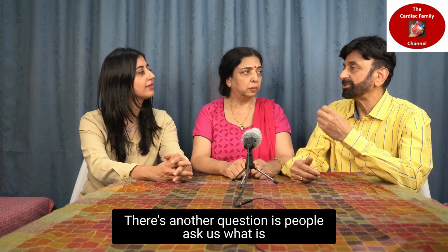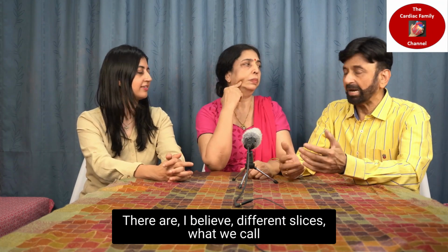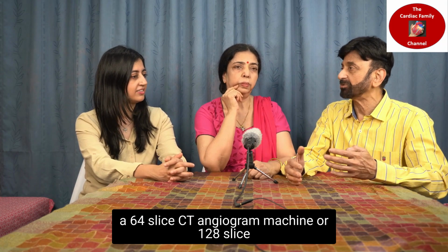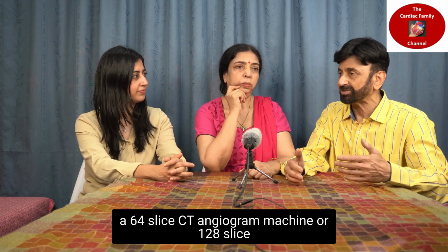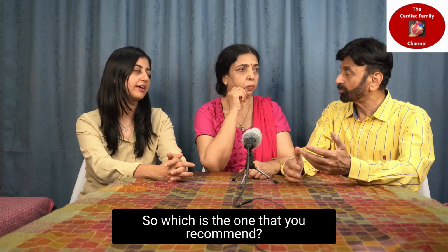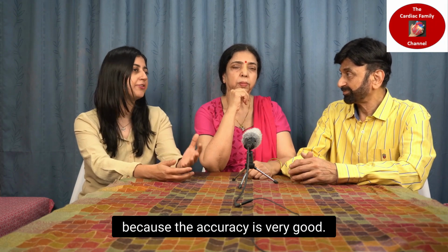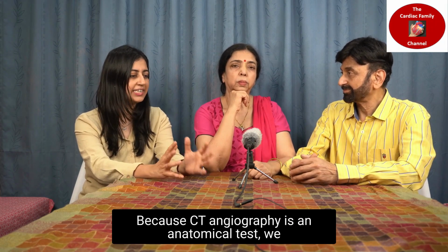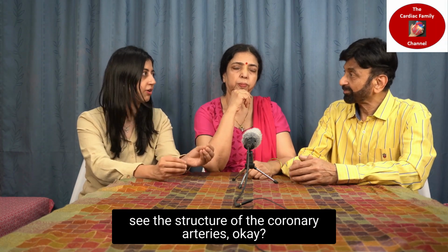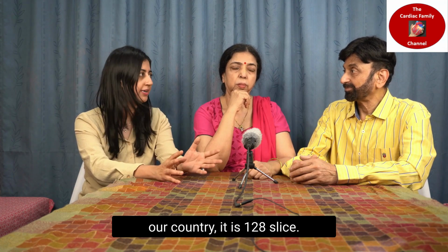There is another question people ask us, what is the type of machine we should go in for? There are, I believe, different slices, what they call a 64 slice CT angiogram machine, or 128 slice CT scan machine, or a 256 or a 512. So which is the one that you recommend? Well, the greater the number of slices the better, because the accuracy is very good, because CT angiography is an anatomical test. We see the structure of the coronary arteries. But generally in most hospitals in our country it is 128 slice.